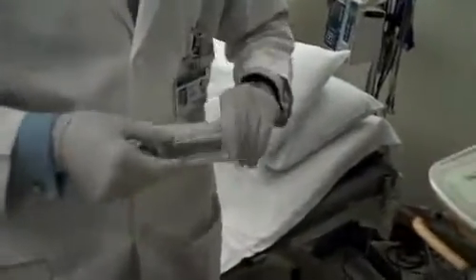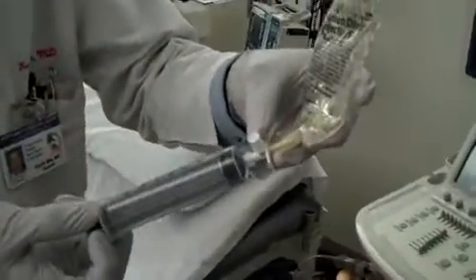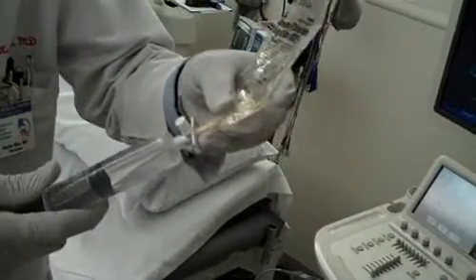In order to make the solution, I just gently make sure that the Definity is resuspended, and I will then take my syringe, connect it to an OptiSpike, and withdraw 28.5 mls of saline from the bag.